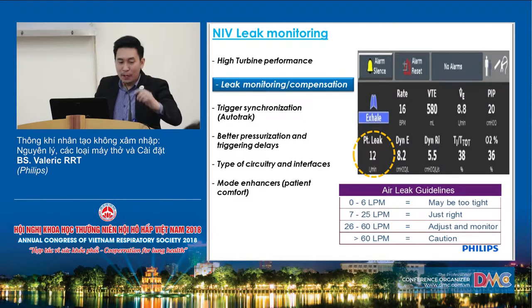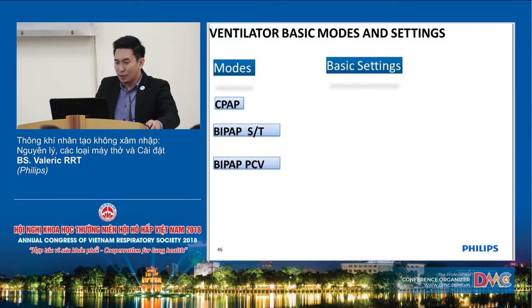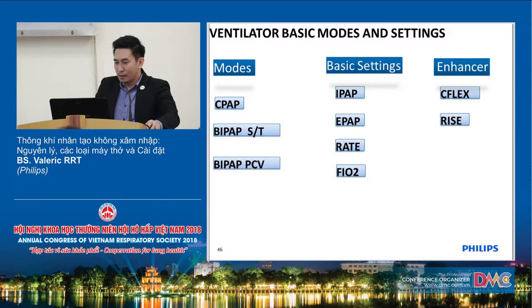So what are the types of ventilation that we are using for non-invasive ventilation delivery? Okay, so let's start with the modes. These are the modes of ventilation, basic modes and basic settings. Are you using these modes of ventilation? What types of ventilation modes are you using during non-invasive ventilation? Do you mind giving me at least two of your favorite modes of ventilation for non-invasive?